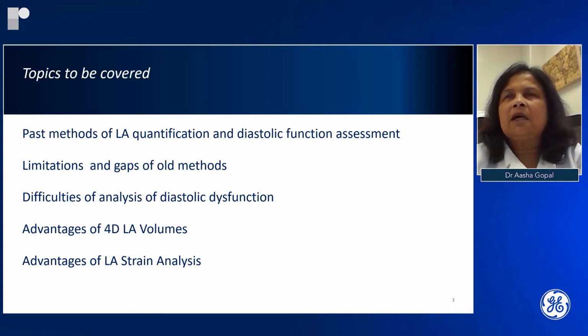Now, understanding left atrial size and function is important because it gives us a glimpse into the diastolic properties of the left ventricle. Furthermore, left atrial pressure and compliance influences pulmonary capillary wedge pressure, or the afterload that the right heart faces. So obviously the gold standard of all of this is to really find out what is the left atrial pressure, to be able to estimate that in the best possible way and to try to evaluate it serially.